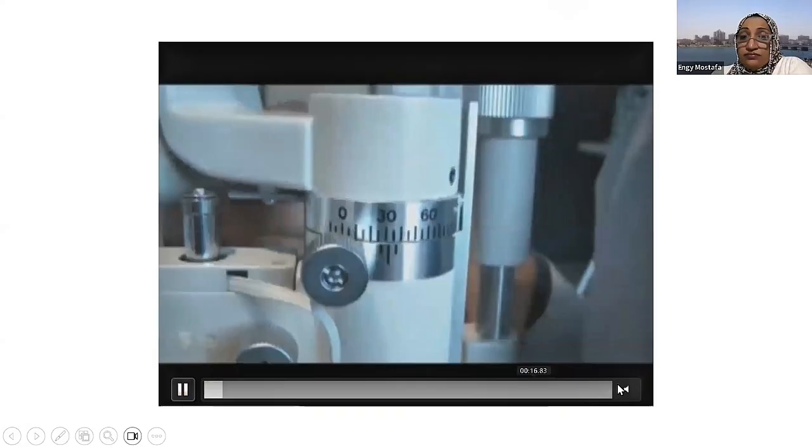So one more point we don't need to miss is the anterior chamber depth. This is also one of the main things we have to examine during our anterior segment examination by the slit lamp. There are two methods. Of course, we are all familiar with the pen-torch method, which we use for crude examination. Here, in the Smith method, you set the illumination at 60 degrees, and the beam is horizontal, directed to the inner side, and then focus between the corneal endothelium and the lens.